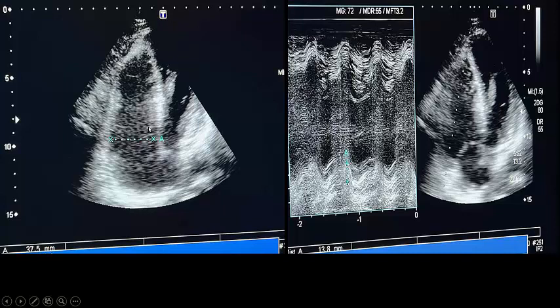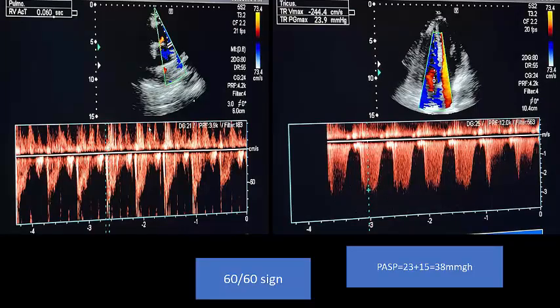Okay, we are facing a patient now: obese after spinal surgery, with acute sudden onset of hypotension, hypoxia, low TAPSE, and dilated right side. That means it's acute cor pulmonale. Dilated right side, compressing the left side with decreased TAPSE, means acute cor pulmonale. So here pulmonary embolism is high on the list.